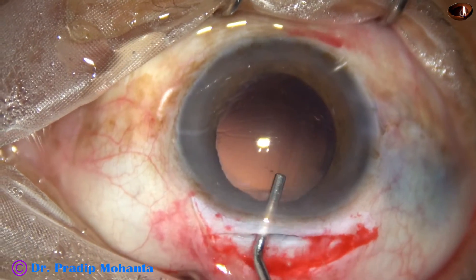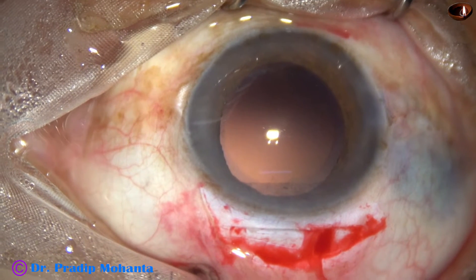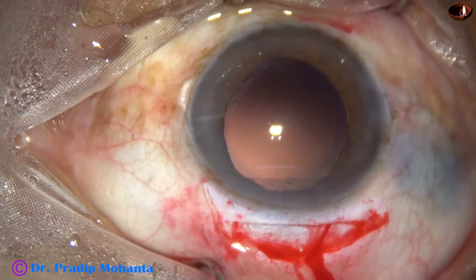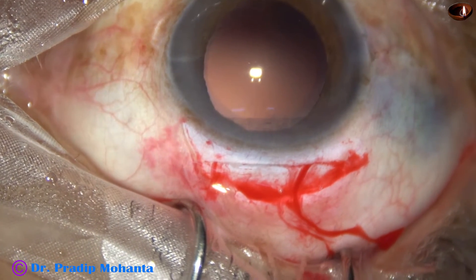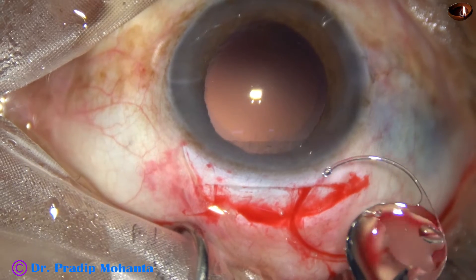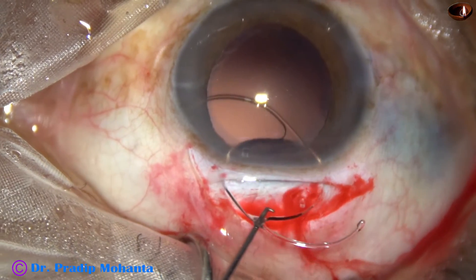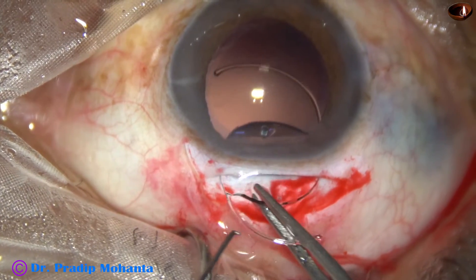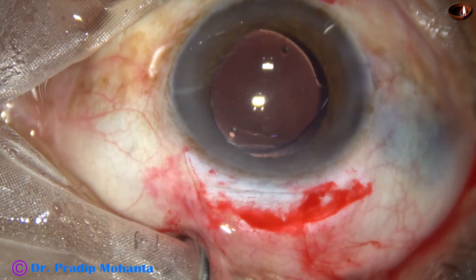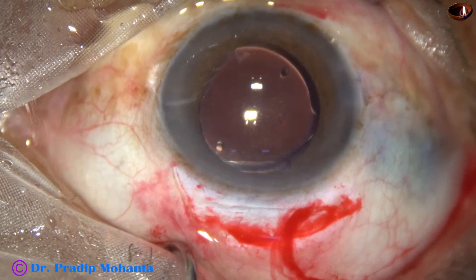The anterior chamber and capsular bag are filled up with two percent HPMC. We are now implanting a PMMA intraocular lens — a single-piece polymethyl methacrylate intraocular lens. This is a rigid lens and a very good lens. The leading haptic goes into the capsular bag first, and then the trailing haptic is guided into the capsular bag using a Sinskey hook.